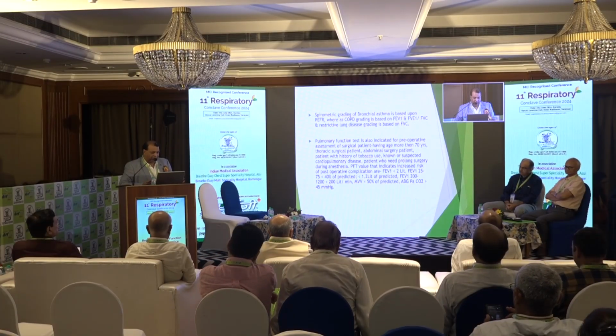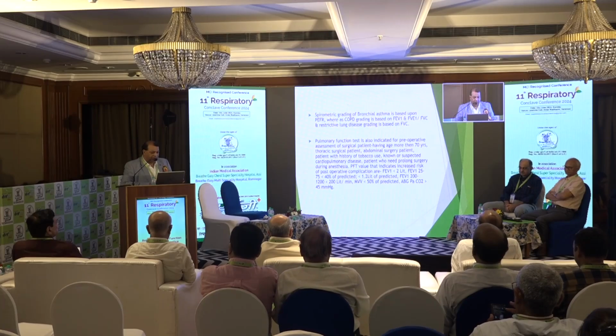Here the very important thing is that pulmonary function tests are indicators for preoperative assessment. If we are going for any surgery, for the surgeon, FEV1 is very important, PCO2 is very important, and if spirometry is not good, then we have to avoid the surgery. Thank you so much. Thank you.